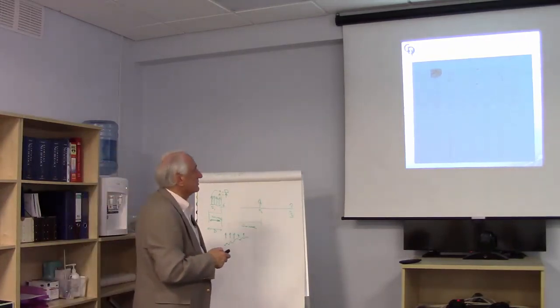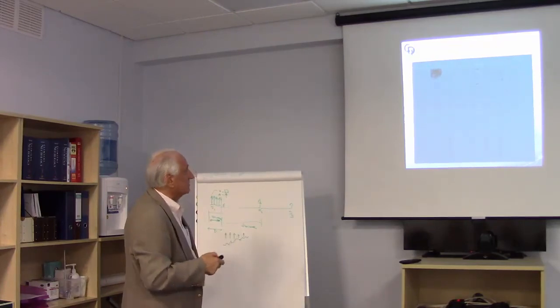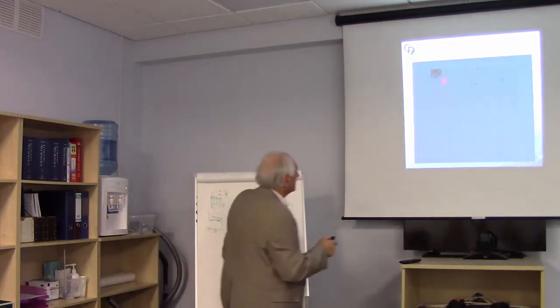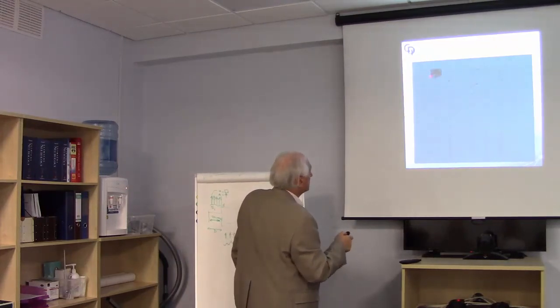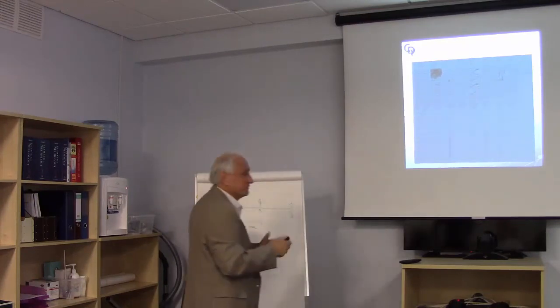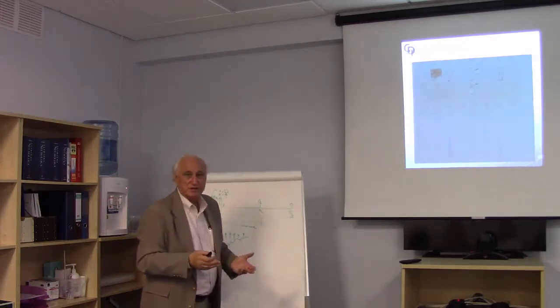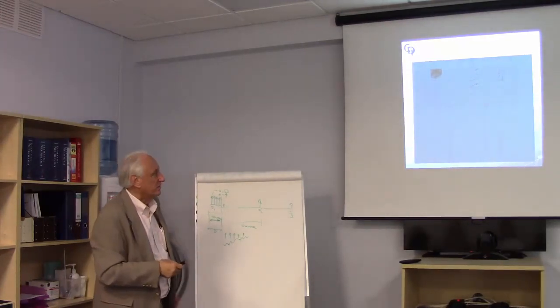These things aren't projecting real great. I'm sorry about that. So these are lumbar nerve EMGs, and you can see two things here. This is continuous EMG, again, the way we like to look at it. These are, I think, 4-second windows. And you can see the irritation activity here and how it dies out eventually. Very clear stuff to see. It's not hard to recognize. It's harder to figure out what it represents.